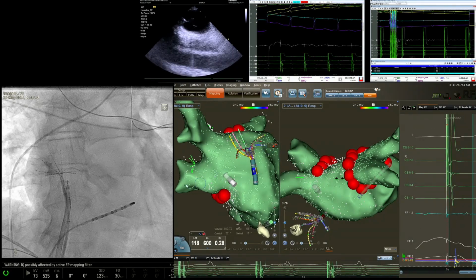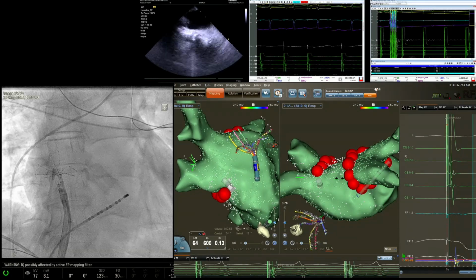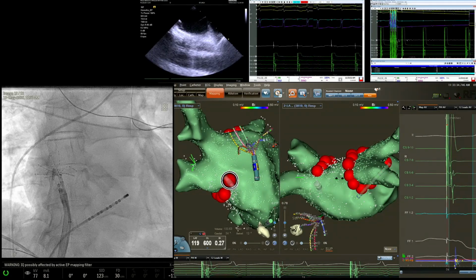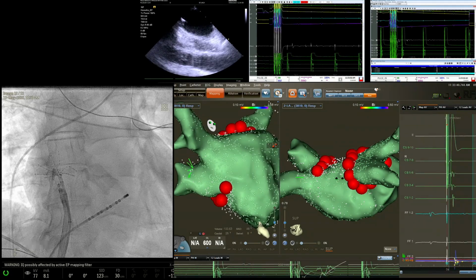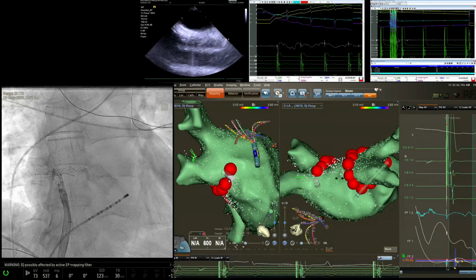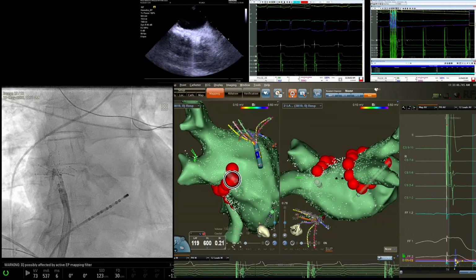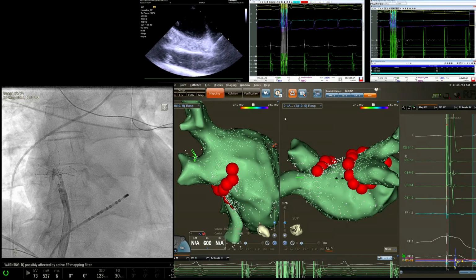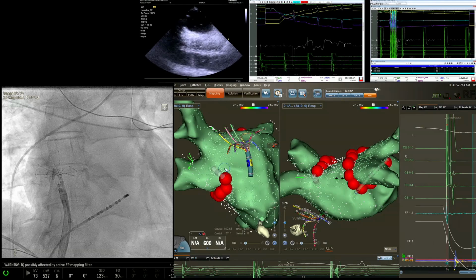Okay, let's go here. Oh, hold on. Okay, I like that. Point, hide, ablation. You know, I don't know if that, rotate up for me. Let's just do one more. I have no idea if that's real location or not. Point, hide, ablation. I'm doing a few more lesions than I normally would because I just don't trust the accuracy here for the obvious reasons.